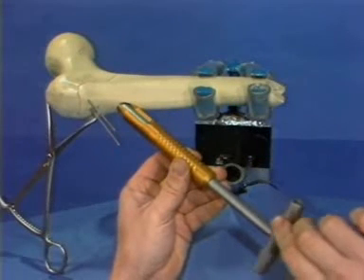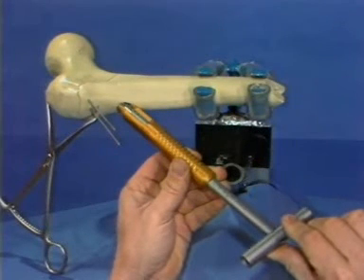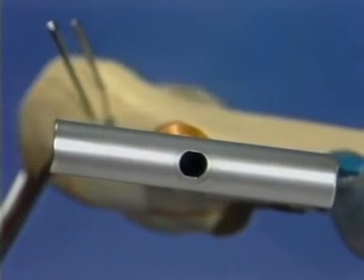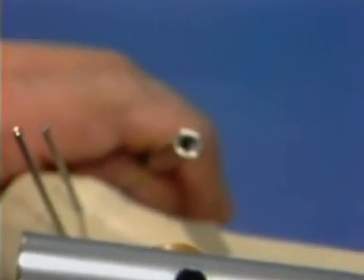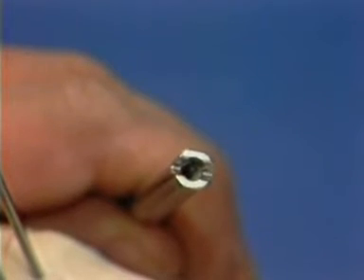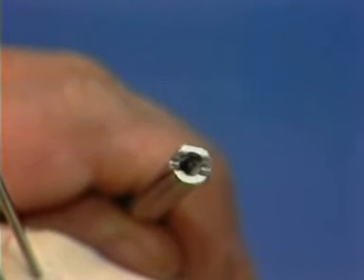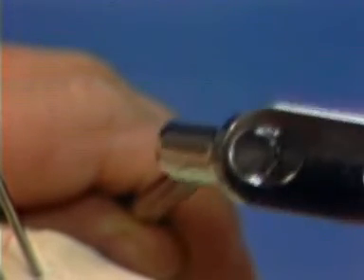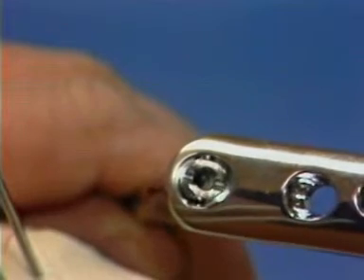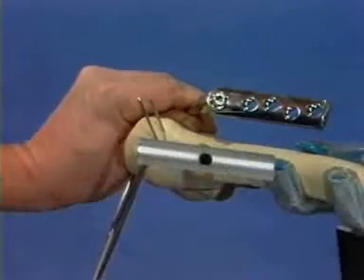At the end of the procedure, the handle of the screw wrench must be aligned parallel to the long axis of the femoral shaft, so that the side plate will slide over the screw. The turning is clockwise only. In observing a screw in this position, it can be recognized that the shaft sides are flat. The hole in the barrel of the plate is similarly flat, so that the screw locks when the plate is applied.